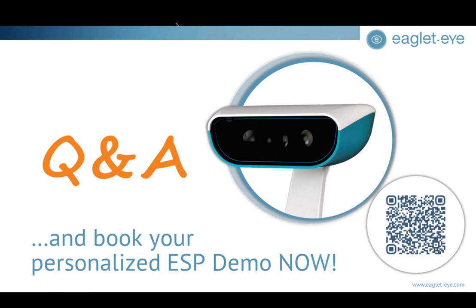Okay. And then when you're using the ESP for, let's say, whether it's OrthoK or it could be RGP, I guess you've got your technicians pretty well trained to know that they don't have to hold the eyelids that wide open. It's a different kind of scan for that particular kind of patient.